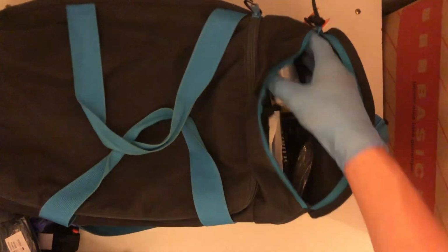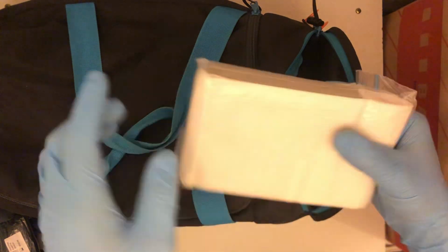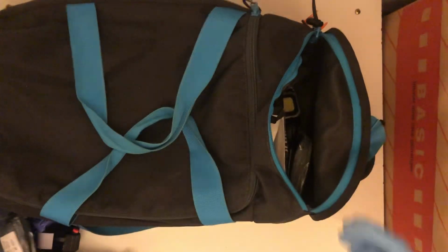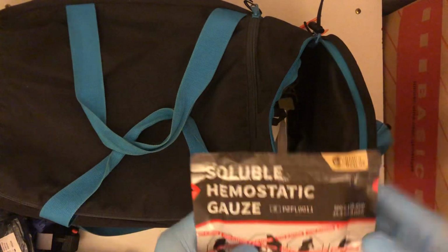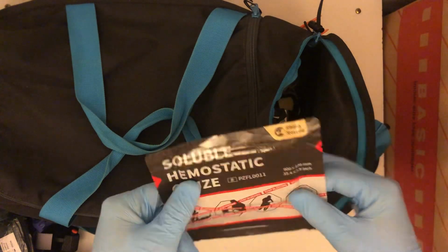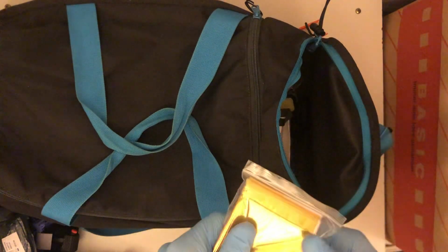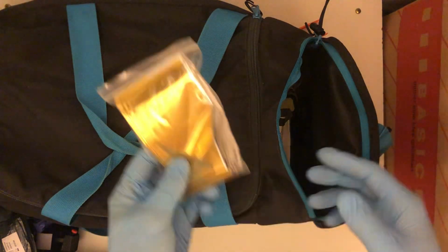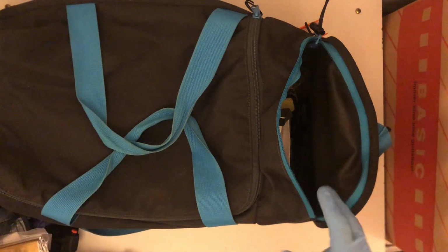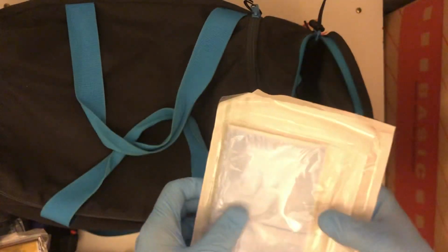Then I've got another pressure pad with some foam. That's something we use in France, and it's pretty useful. It's a third dressing. Then, in case these don't work or you're in a junctional site, I have hemostatic gauze that works as well. It's not mandatory, but it helps. I just have it in the home kit. Then I have a mylar blanket in case something happens in the garden. You've got to take care of the heat of your patients, so hypothermia prevention.